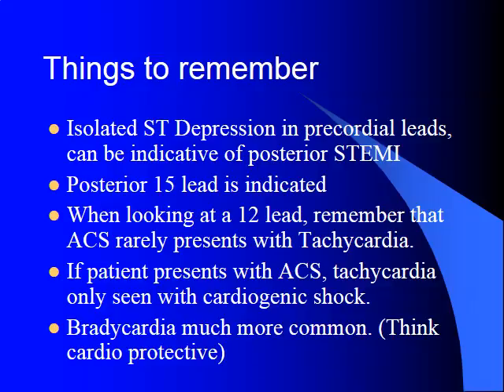But generally, whenever we're looking at this as a sign of ischemia, it's going to be a global presentation. So it's going to be our strain patterns or ischemic patterns where we have that T-wave inversion in multiple leads throughout the EKG. So in this particular instance, we're talking about ST depression that is localized.